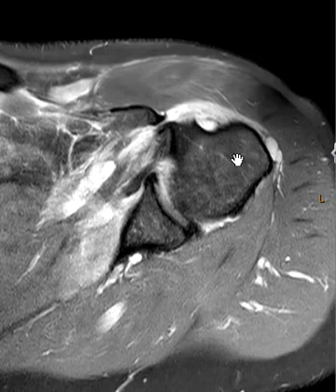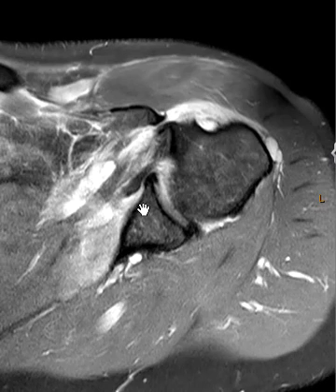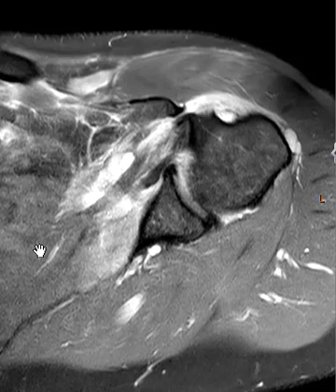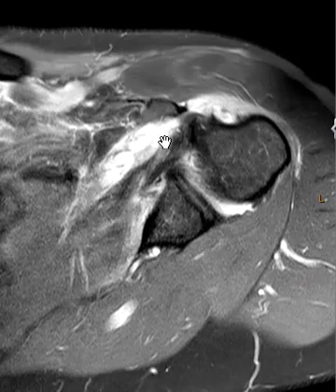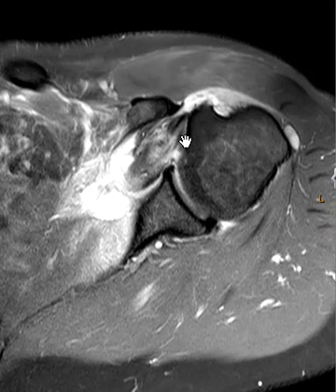On this axial PD fat sat view we see the humeral head, we see the glenoid, and we're going to go down and see the subscapularis. The muscles are back here, and as we go forward we see some edema in the deep muscle fibers along the undersurface. The musculotendinous junction is back here retracted, and the tendon coming across here shows an ill-defined fluid-filled gap — consistent with a full thickness tear of the subscapularis tendon superiorly.